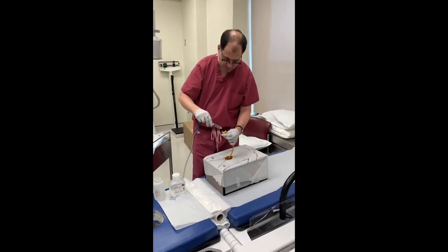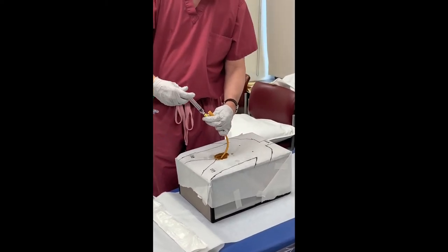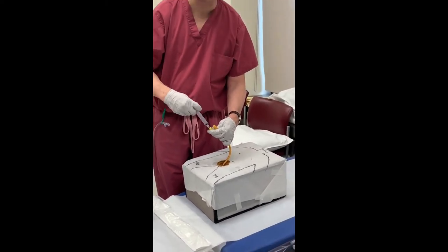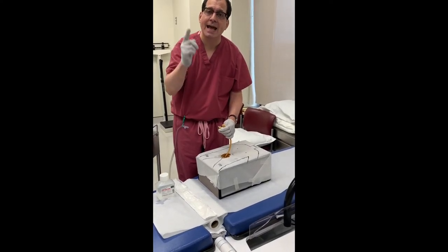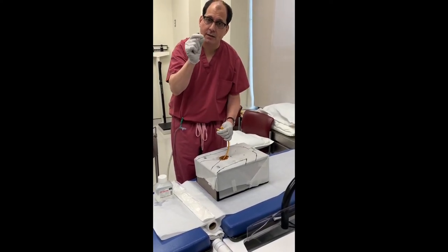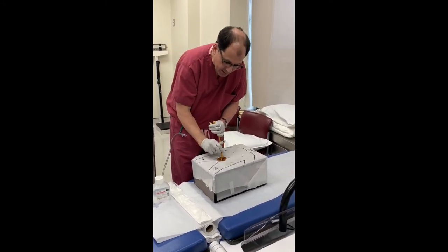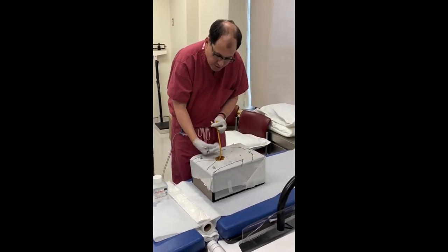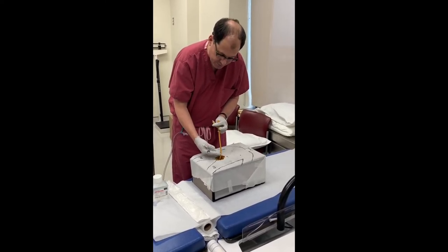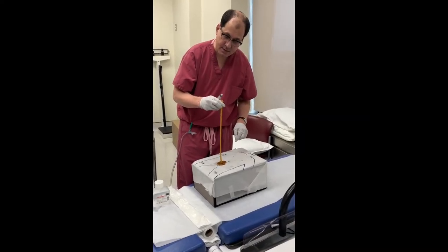Take your syringe and blow it up. If while you're inflating the balloon you have horrible pain, that means it's not in the right place — you shouldn't have any pain, zero pain. If you have pain while it's inflating, just advance the catheter a little bit. Most of it should be sticking out of the body. Once it's inflated, pull it back until you feel some resistance.